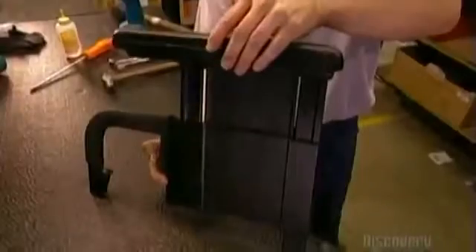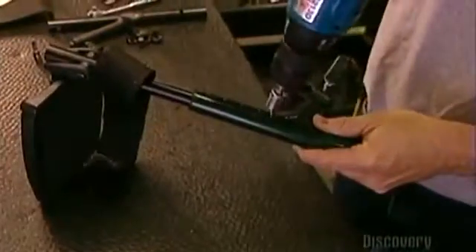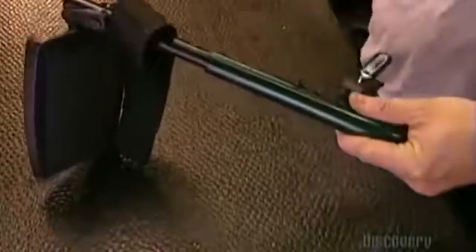Workers test the height adjustment lever for the armrest. Then they install a removable aluminum footrest, setting it to the desired length. It has a heel loop to prevent the user's foot from slipping off.